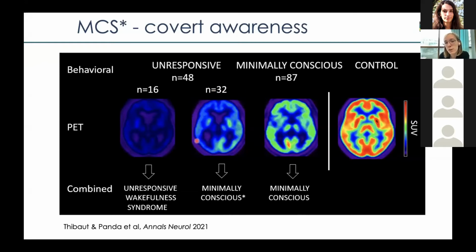However, actually the biggest part of the patients who are unresponsive at the bedside show a glucose uptake that is relatively preserved, or it is higher than what we would expect if the patient was truly unresponsive. And these patients are termed minimally conscious state star.